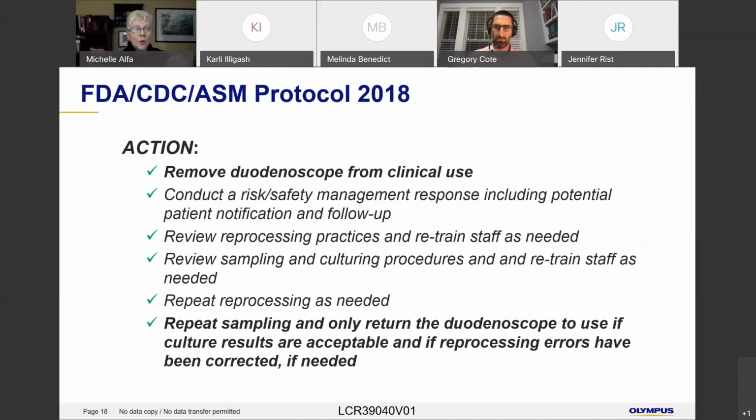Therefore, one of the first steps you should do is look at how the sink in the reprocessing area is being used. Is it being decontaminated after each of its uses? Is the submicron membrane filter in your AER broken, and that's why you've now contaminated it with waterborne Pseudomonas, and it's showing up in the final rinse water of the AER? So a practical approach based on where that microorganism might have come from is important.